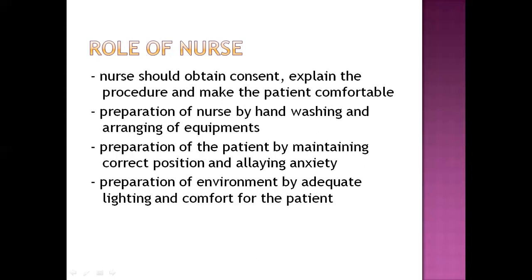Preparation of environment can be done by adequate lighting and comfort of the patient, as the patient needs to visualize the chart and identify what the nurse is showing. So adequate lighting in the room is very important.